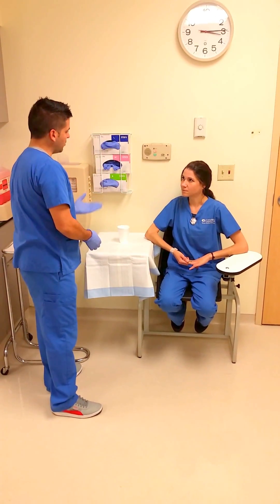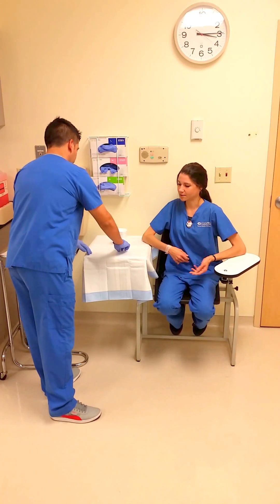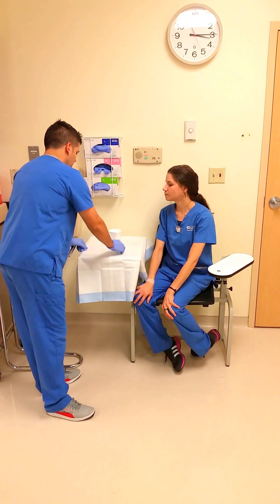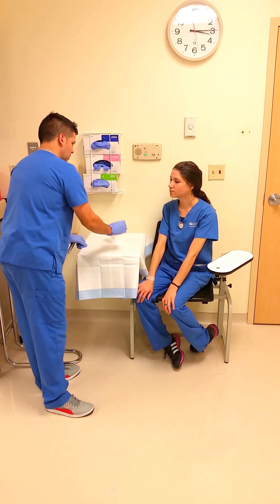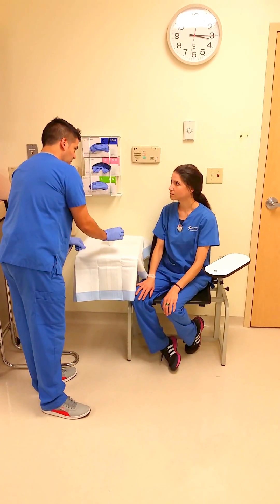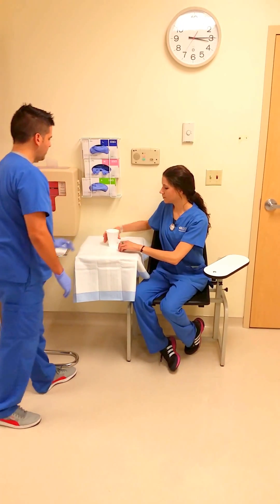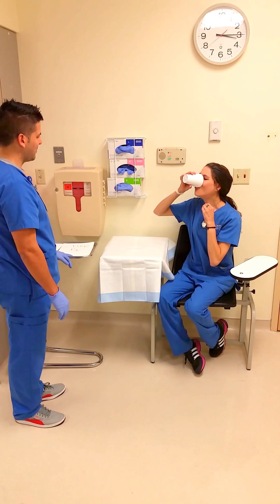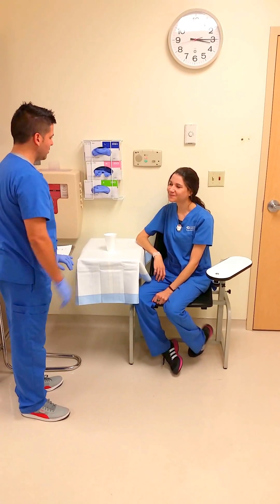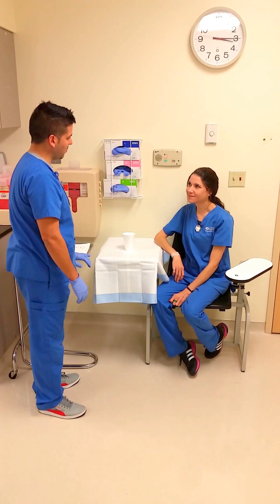If you get into therapies, then it's a very different story — you'll get a different set of instructions. This could potentially tell my doctor if I need a therapy or something like that? Exactly, that's correct. So this iodine capsule is actually in a plastic vial. If you take this capsule, don't touch the pill itself — just take it through the plastic vial. You're safe to drink normally for the next couple hours. Wait two hours to eat, and we'll see you in four hours.